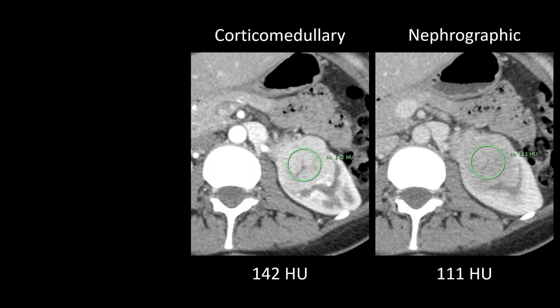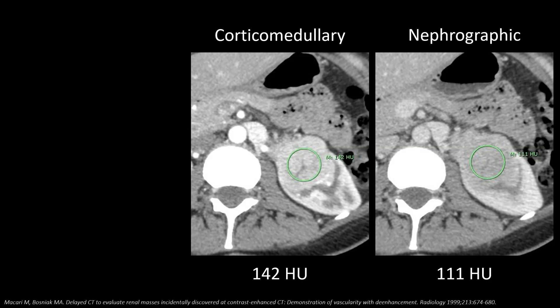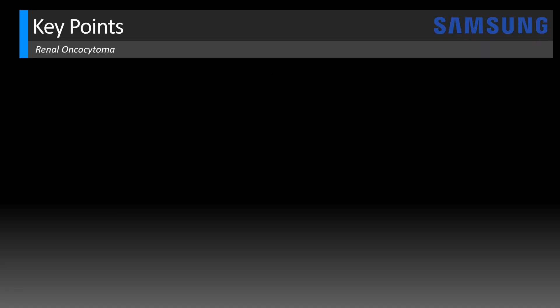What if we only had an enhanced phase and a delayed phase without non-contrast imaging? Doctors Macari and Bosnia did a study showing that if a mass is hyperdense on enhanced images and then drops in density — or de-enhances — by 15 Hounsfield units or more, assuming no vascular abnormality, that indicates a solid mass. A hyperattenuating cyst would tend to stay the same density over time. The rapid drop here of much more than 15 Hounsfield units confirms this is a neoplasm. That concept can help when dealing with a limited CT scan.